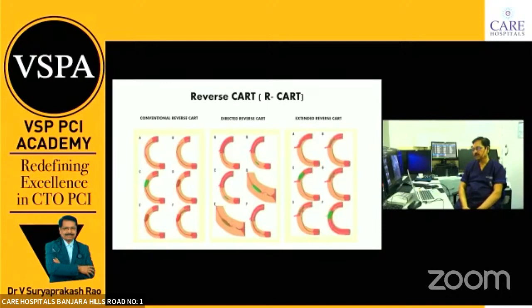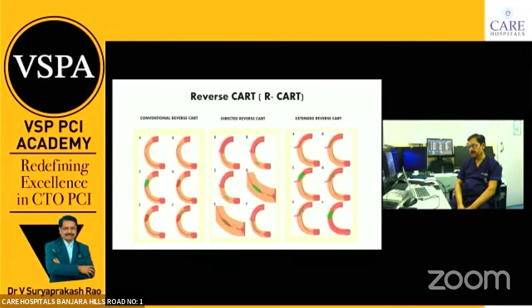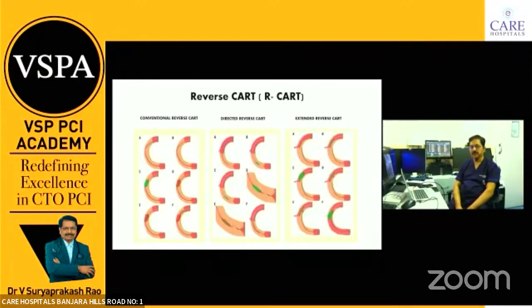So these are the different types of reverse CART. What I told is the conventional reverse CART. The other one is in a long segment of CTO, like RCA CTO, you pass the antegrade wire to the distal portion of the CTO. Then at that portion you have a small balloon and direct the retrograde wire towards it. Usually the Gaia 2 is the favorable wire towards that balloon.